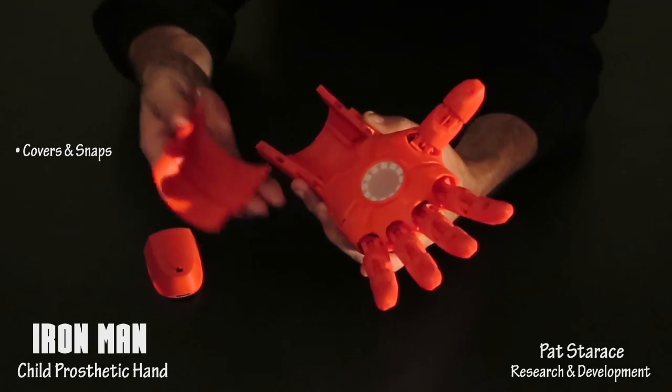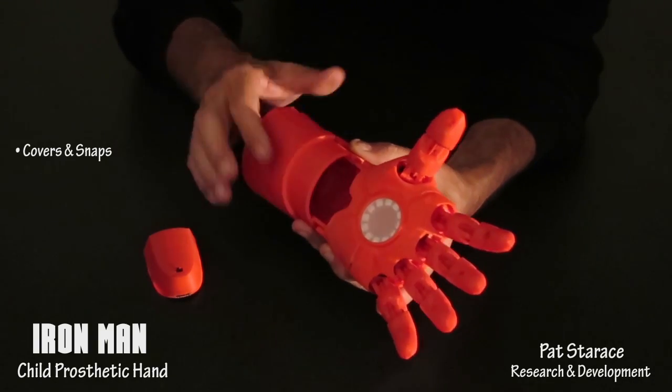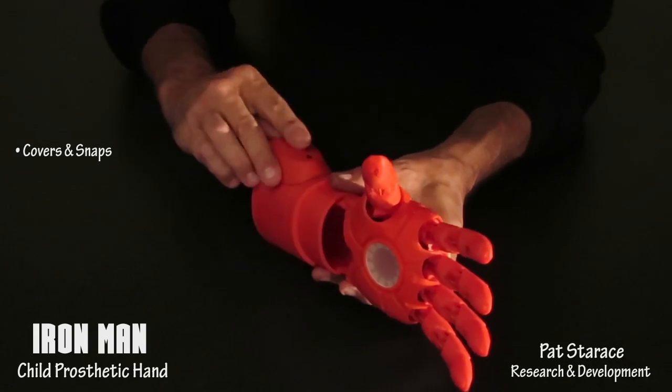Slide the arm into the Iron Man hand. There are anchor points for straps if needed. Then snap the bottom of the gauntlet back on and snap on the electronics module.